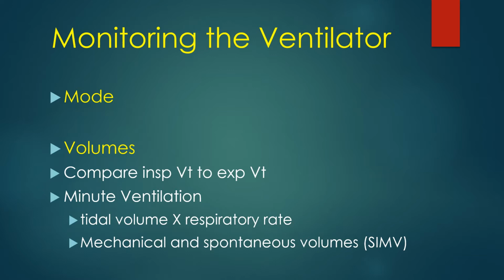Now, in some cases, you may want to increase the tidal volume on his ventilator to 600 to make sure he gets 500, but that's on a case-by-case determination. So at any rate, you need to be a bit of a detective here and try to figure out what is happening to that tidal volume.